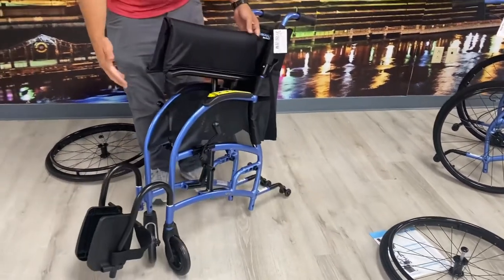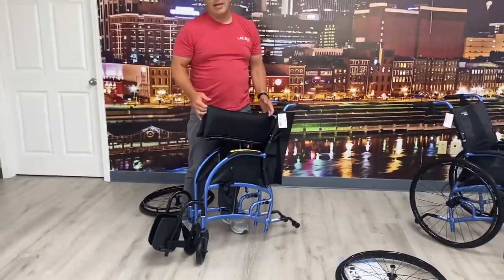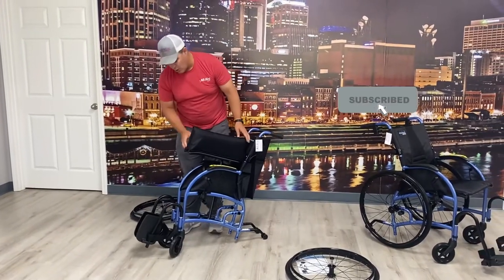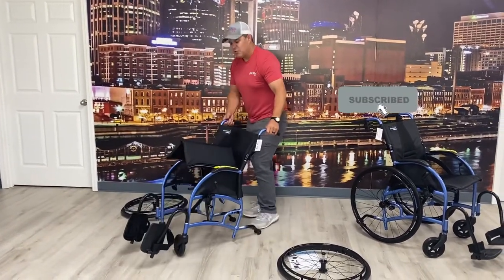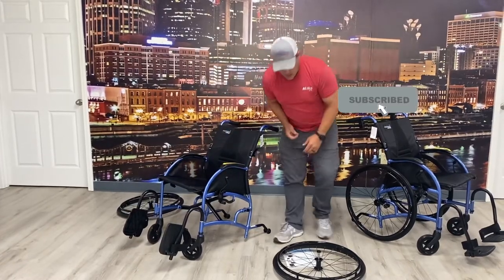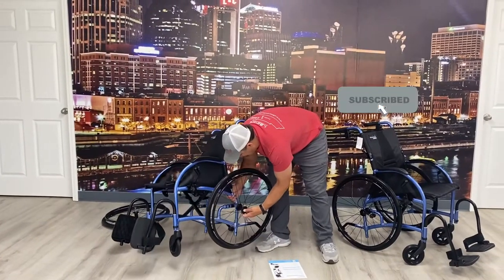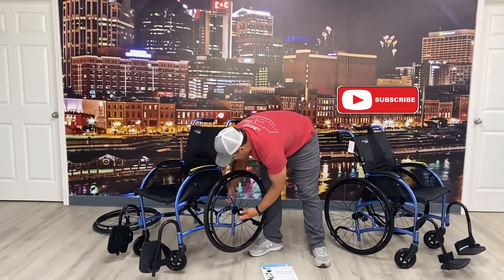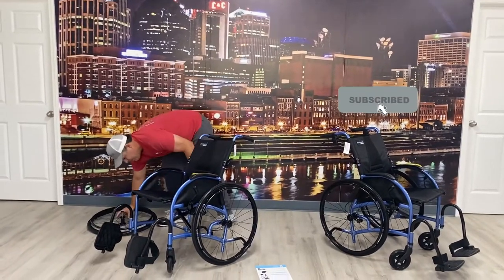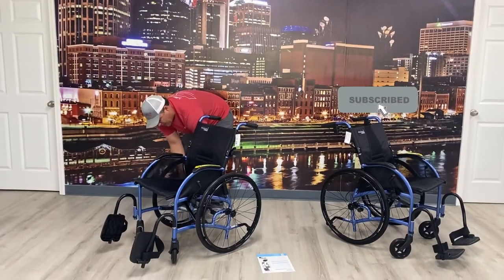When I fold this up and if I take the leg rest off, you can actually get down to as little as 13.8 pounds. It's really light. That can be super beneficial when traveling or putting it in the trunk of a car or backseat. They're very easy to put back on — I just slide this back in here, slide it, and it pops right back in. They're flat-free tires so you don't have to worry about pumping them up.